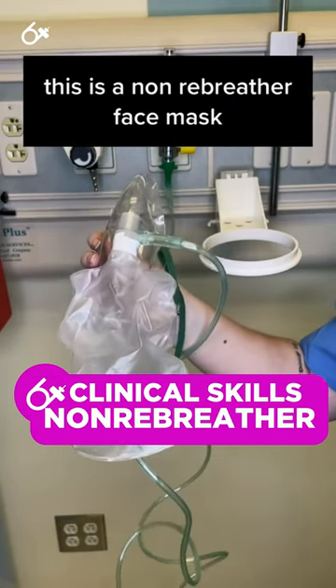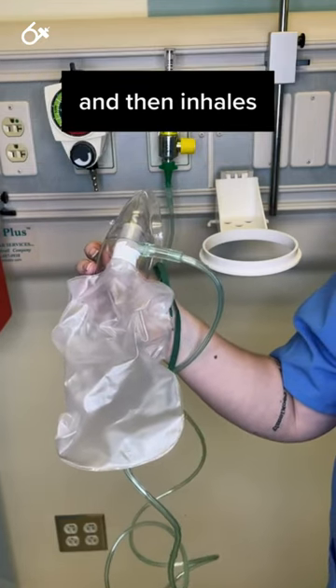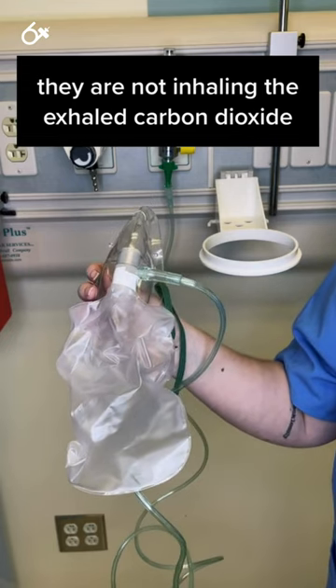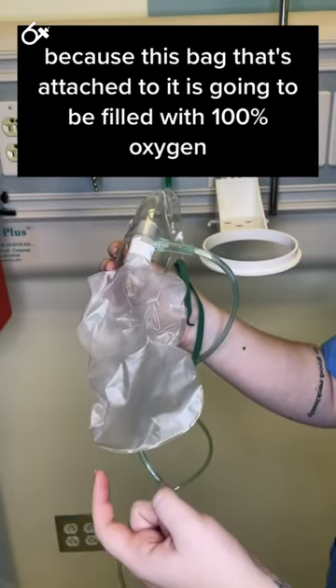This is a non-rebreather face mask. What that means is that when a patient exhales carbon dioxide and then inhales, they are not inhaling the exhaled carbon dioxide — they're not rebreathing it — because this bag that's attached to it is going to be filled with 100% oxygen.